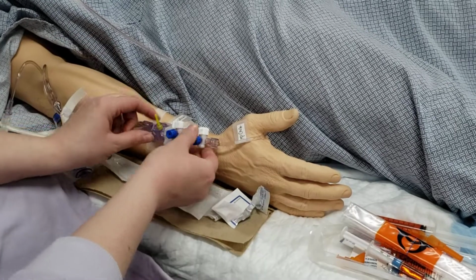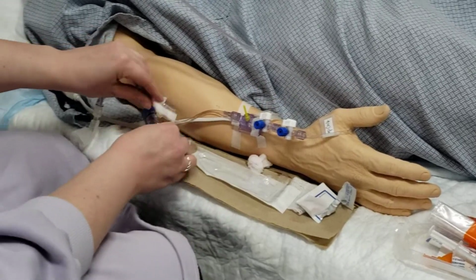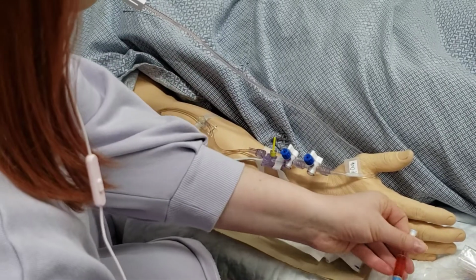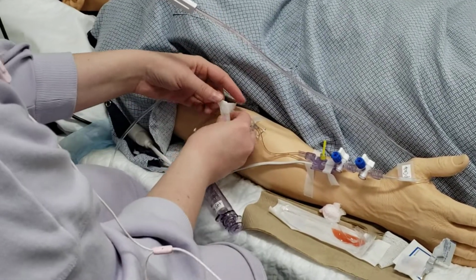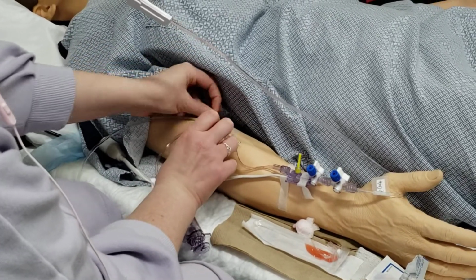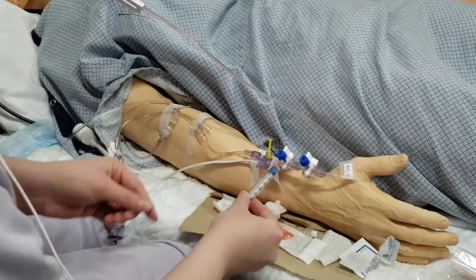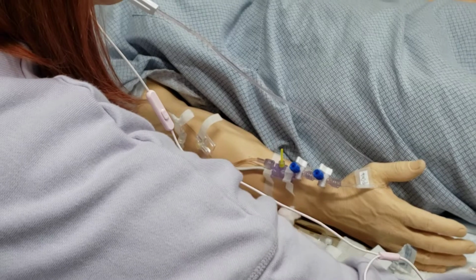That is the stopcock setup, which is this portion of our arterial line. And then over here, sorry, it's not the most sticky of patients. Okay, and then over here is the safety set. It's a little bit different setup. It's this portion. What happens is this all stays in one section, and what you're going to need for it is your ABG kit with the needle attached, and an alcohol wipe.